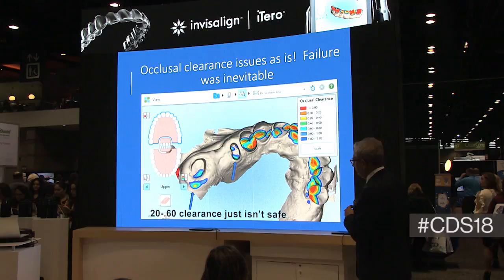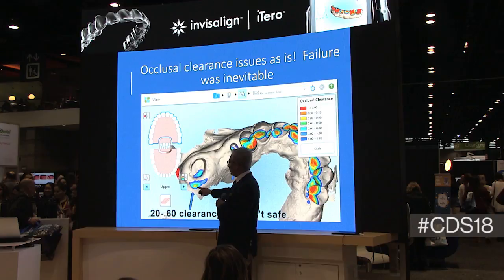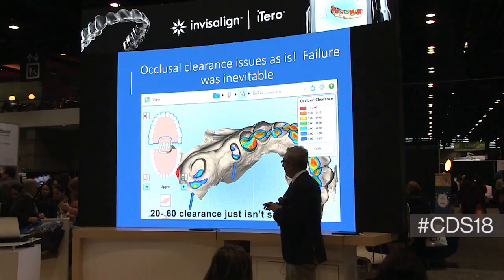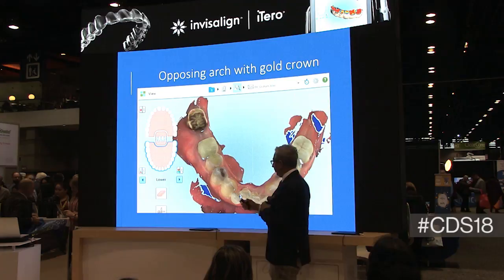preoperatively, on this zirconia bridge, is 2/10 to 4/10 thick right here. Can zirconia handle that? Absolutely not. So if you have a short tooth, how are you going to create occlusal clearance? You're either going to adjust the bottom, adjust the top, or you're going to have to come up with a different restoration than zirconia. Minimal occlusal clearance here for this bicuspid, and it's a short tooth. The opposing has a gold crown and a porcelain to zirconia crown on number 30.